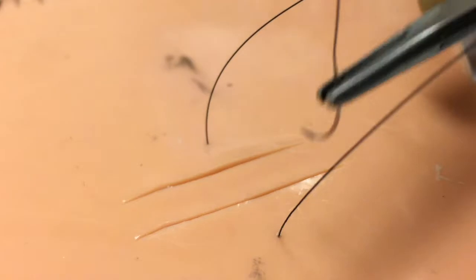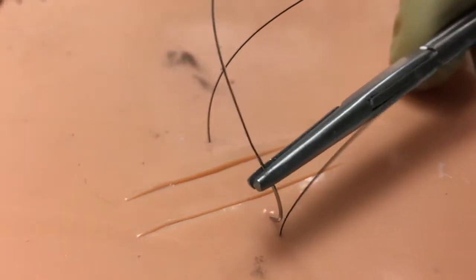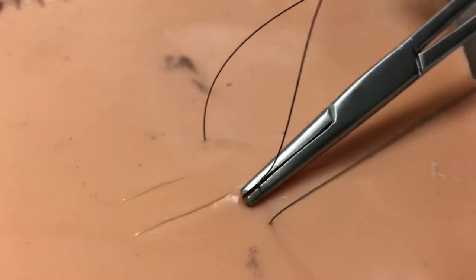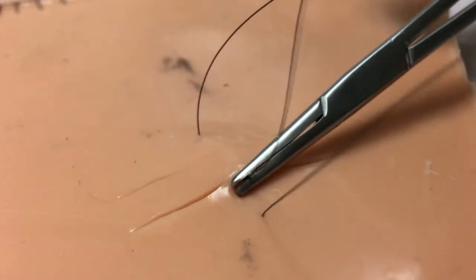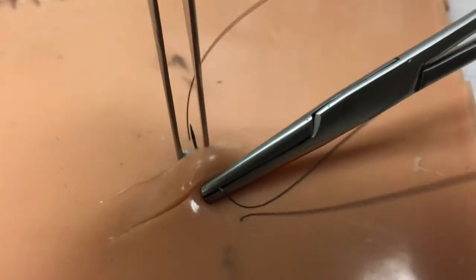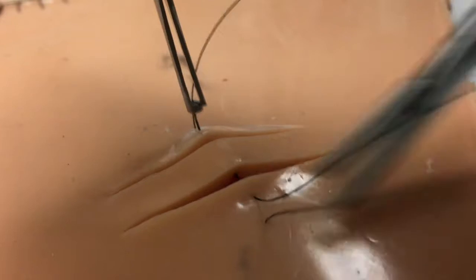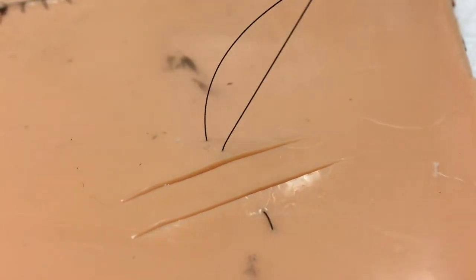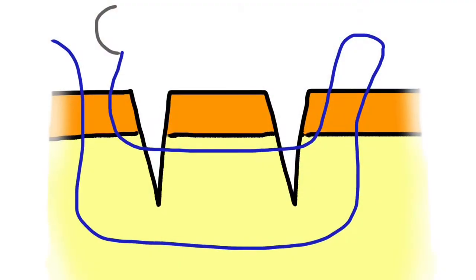The next step will be to backhand that same suture and now throw it back in the other direction, starting on the near side of the wound, going through the epidermal layer of the near side, placing the suture through and through the dermal layer of the intervening tissue island, and then pulling the suture through such that it lays much like a vertical mattress suture would lay, which we typically use for distributing tension on a single laceration.